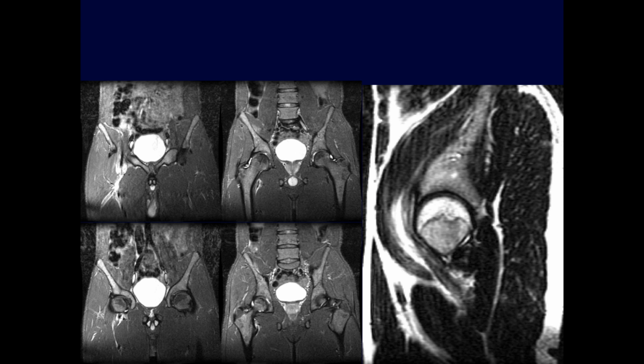So again, we're talking about traumatic lesions around the hip. Yeah, so I see edema in the muscle immediately anterior to the hip. I'm wondering if this is a psoas right here. Through here.